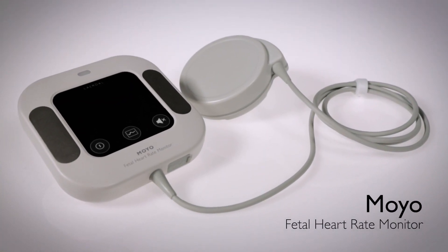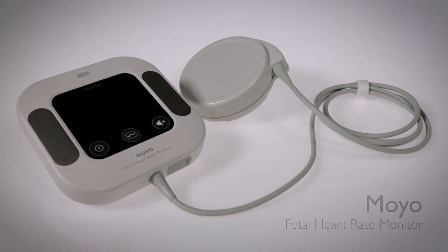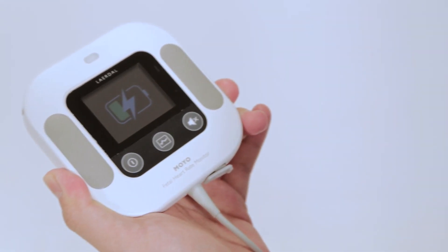Moyo is a compact digital fetal heart rate monitor. Moyo can be used for up to 10 hours between charges.